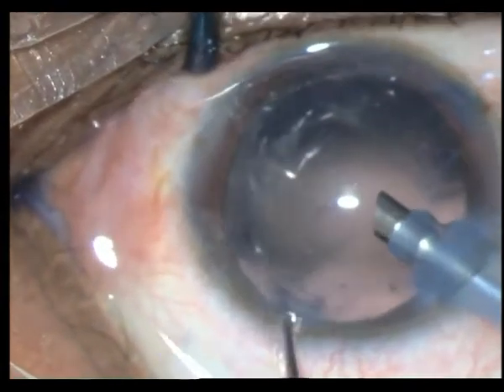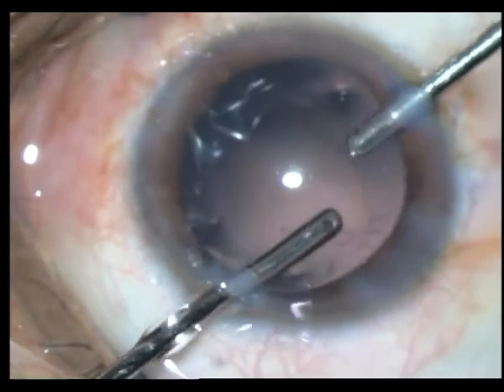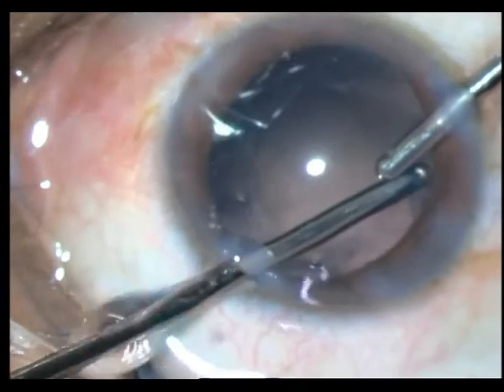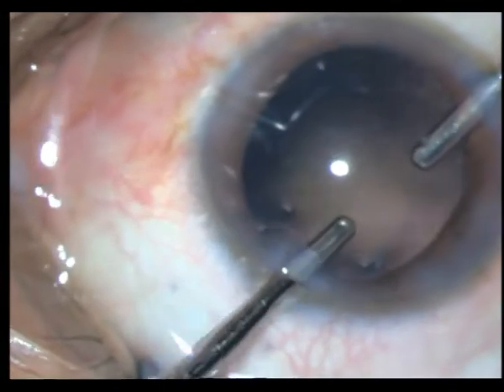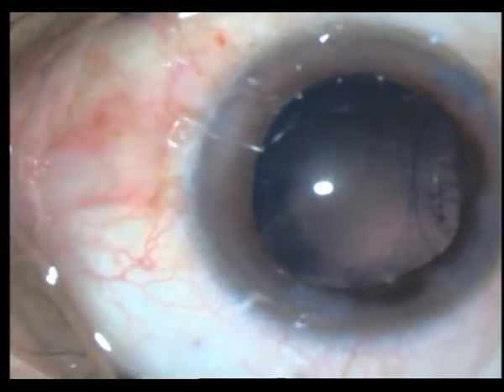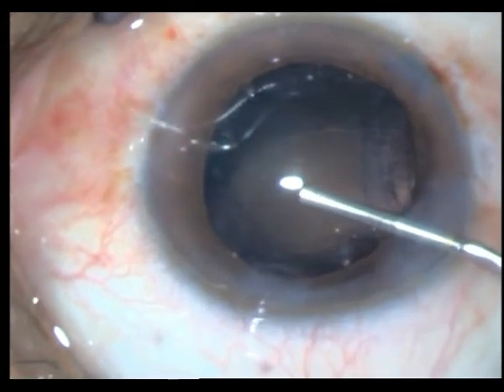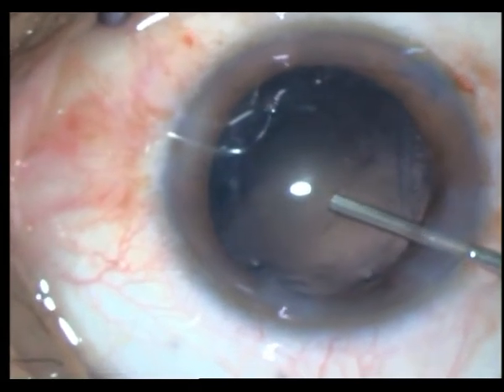There comes the cortex as well. In many of these mature cataracts you will have very sticky cortex at the fornices — and herein lies the danger. You can see how I have gone a little too far: that was not cortex, that was actually the bag coming out. Once I come out, you can see the bag being lifted up — there are at least two to three clock hours of iatrogenically induced zonulodialysis.